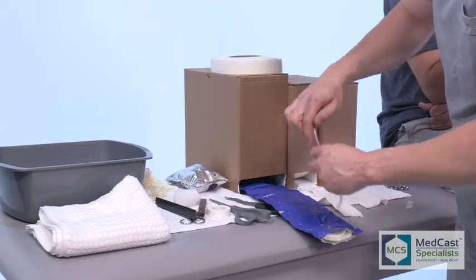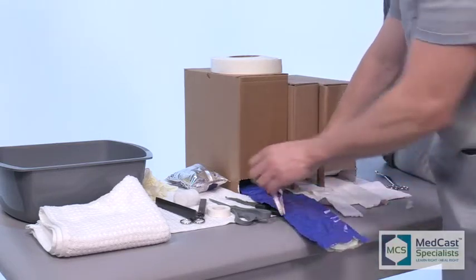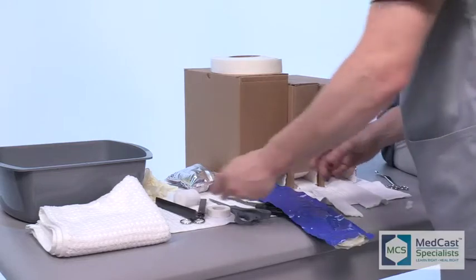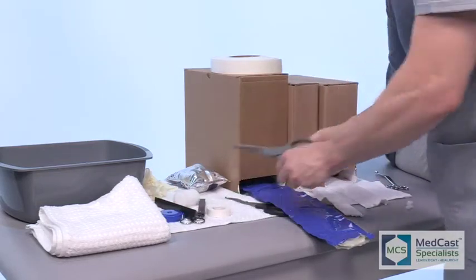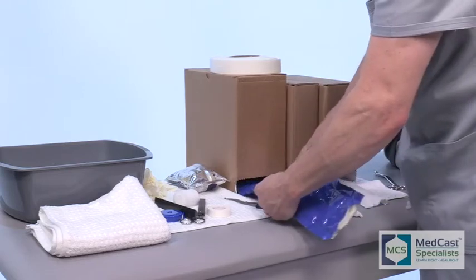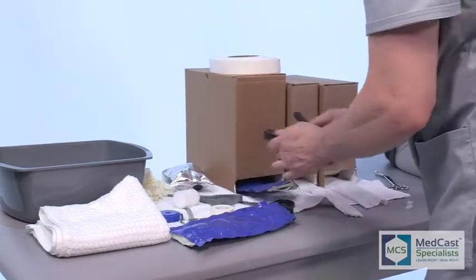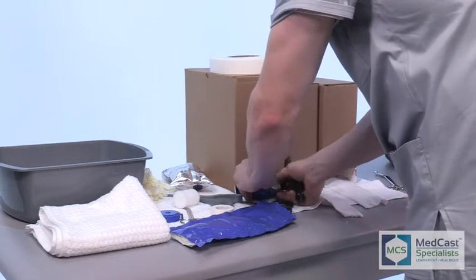Early on when we started doing ulnar gutter and radial gutter casts, we noticed that if we didn't reinforce these, oftentimes they would break, especially in a teenage adolescent person. They would break right down on the volar aspect or sometimes even on the dorsal aspect of where the outrigger comes out.